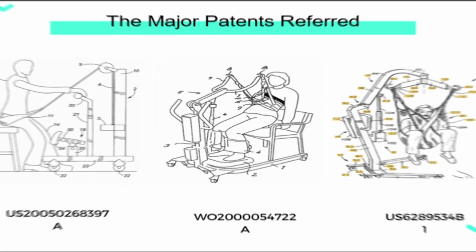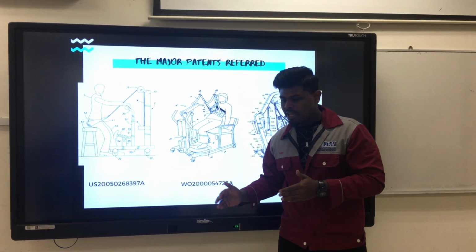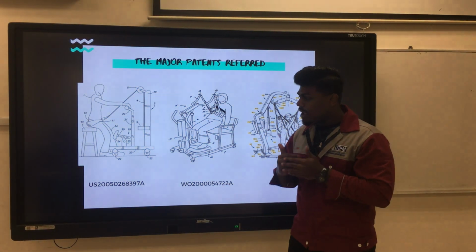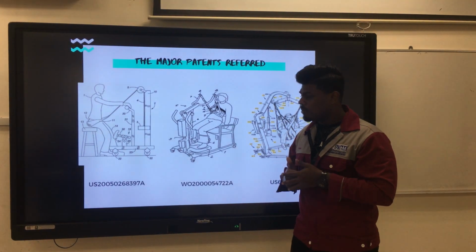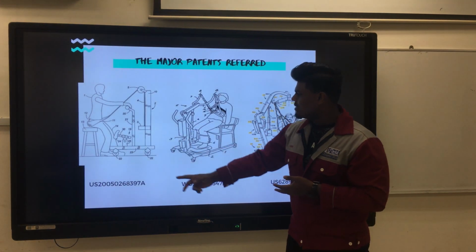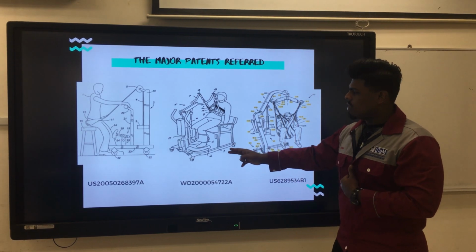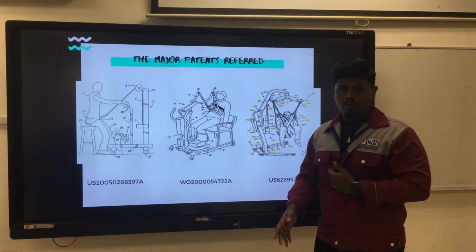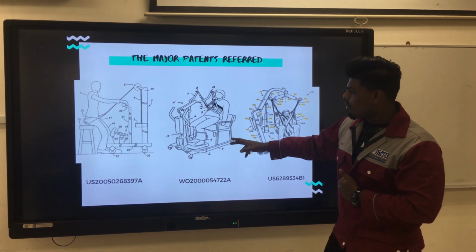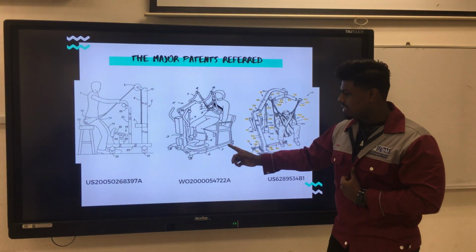Well, the patient or the person who's about to be transported has to be seated first. We cannot simply scoop them up while they are on their bed. So they have to be seated in order to get them into position, which is the standing position, to transport them. Now next, this particular prototype is more of a stroller where we have applied onto our base, which consists of 6 wheels. So the concept of securing the patient and then strolling them to places will be this prototype.